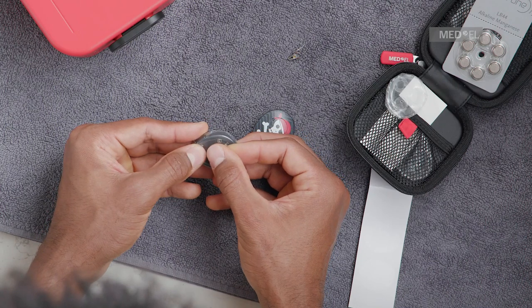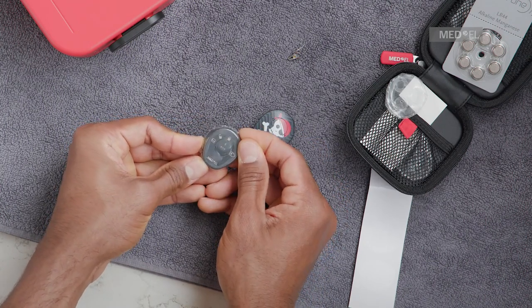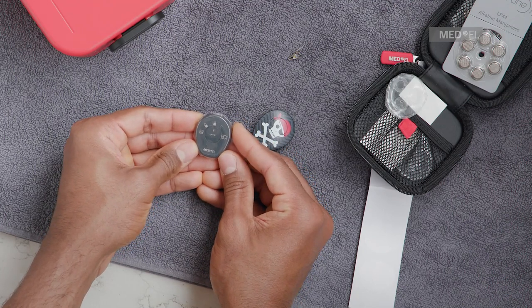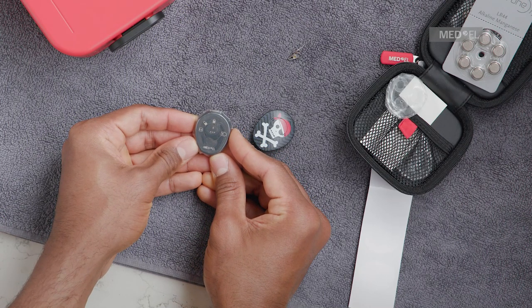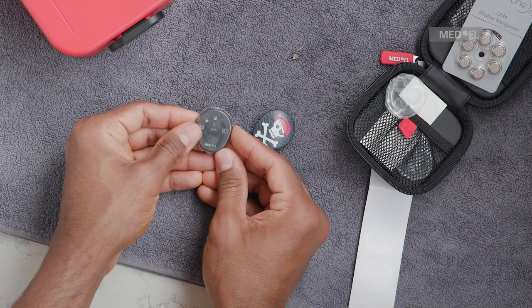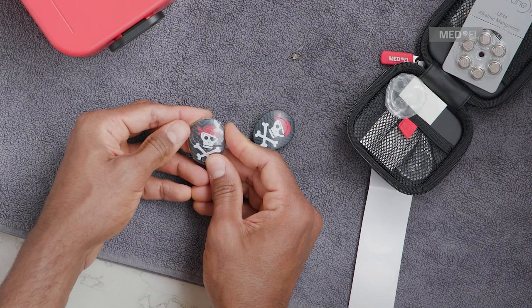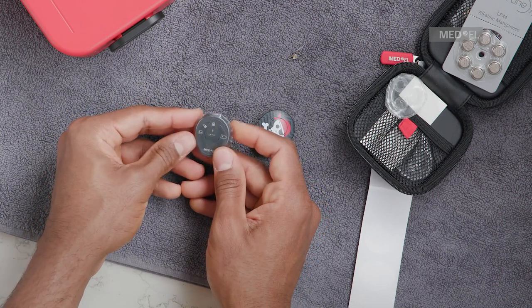Make sure that both flaps of Waterwear remain flat on the surface of Samba 2 and that no wrinkles form during the application of the adhesive seal tape. Also ensure that the tape fully seals the Waterwear skin and is not offset or misaligned. Firmly press down along the adhesive section to make sure that Waterwear is completely sealed. Make sure that Waterwear was not damaged during the application.